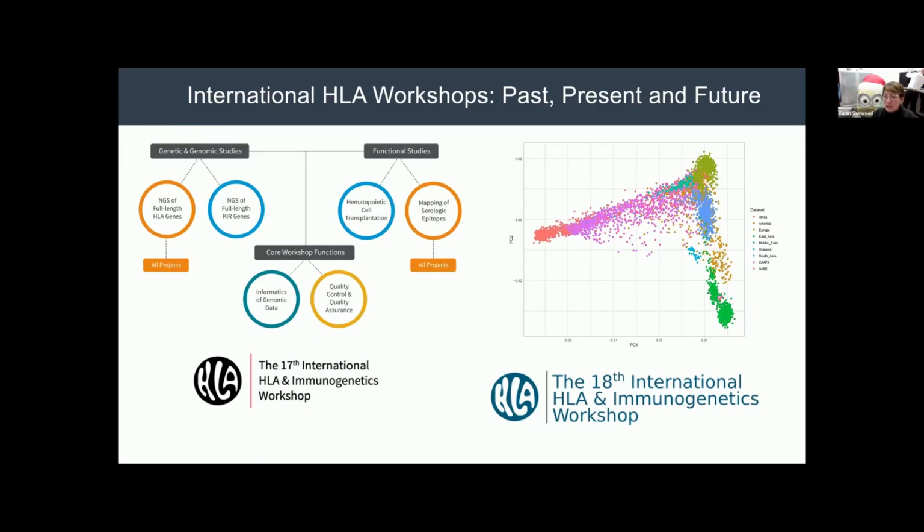So then the 17th International Workshop explicitly focused on NGS for histocompatibility and immunogenetics, organizing a pilot proficiency testing program in which multiple laboratories sequenced standardized cell lines using different NGS platforms. The consensus genotypes from these multi-center efforts became benchmark data sets highlighted in publications from IMGT and repositories, and these validated clinical pipelines.